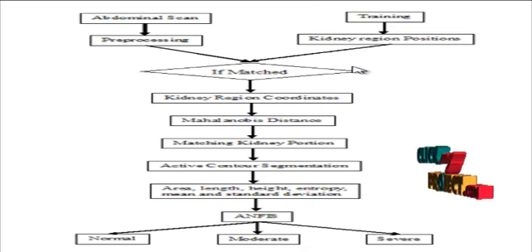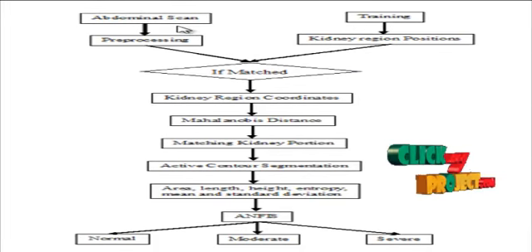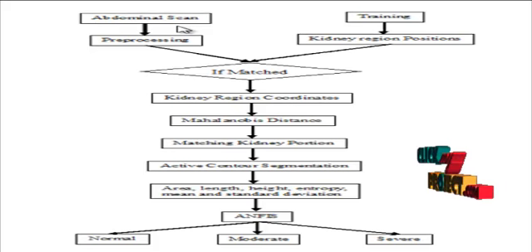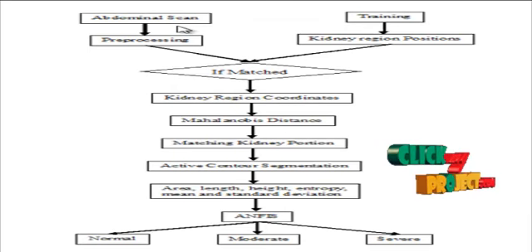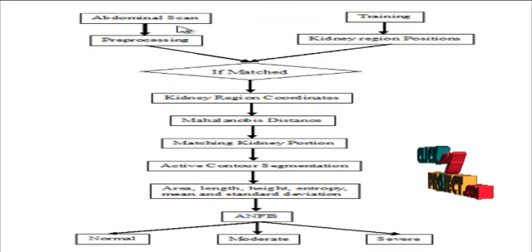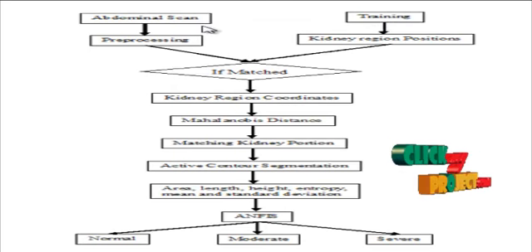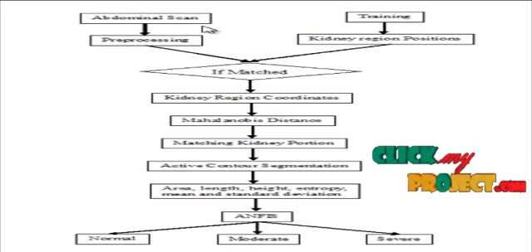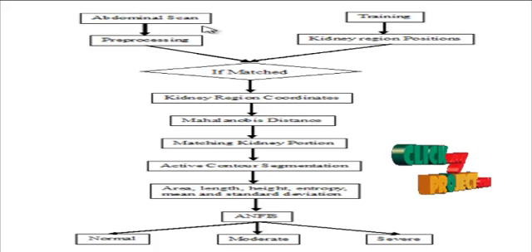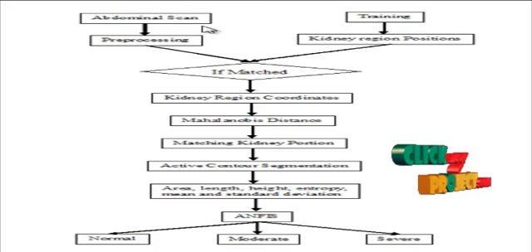Let me see the flow of the process. The input abdominal scan is obtained. So this contains the normal 2D MRI images. The obtained images were pre-processed. After the pre-processing step, we train on the images in the dataset that we have given by saving the shapes of the kidney locations in all the images in the dataset. This process is the registration process.